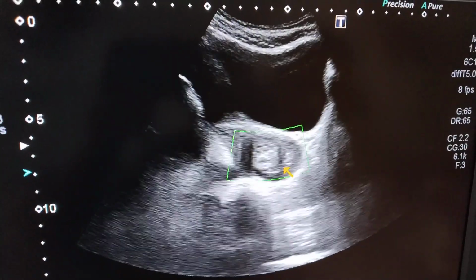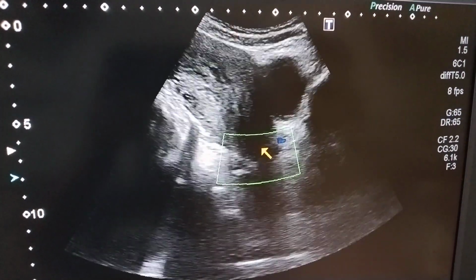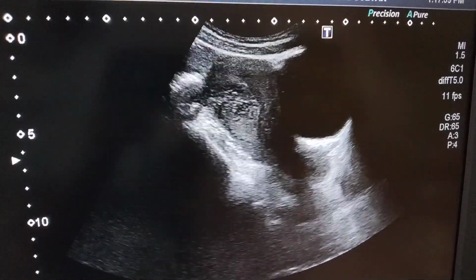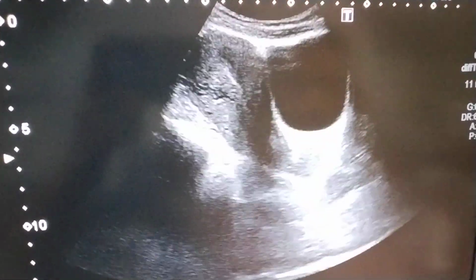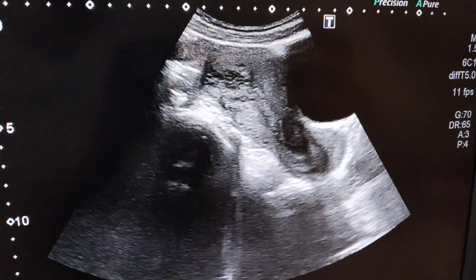So now I'm going to focus on the uterus. Just keep in mind that this patient is unmarried.